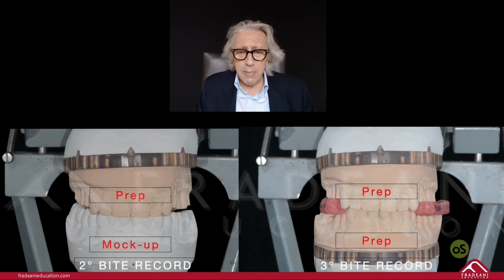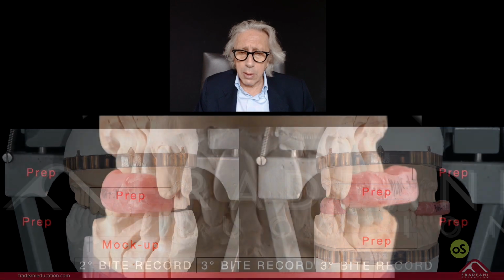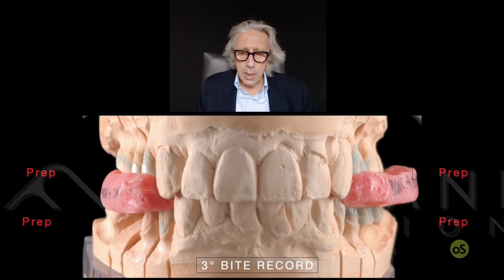So 2 of them are already good. So preparation with mock-up can be upper or lower, or the other one is one of the 2 that we have seen. But 1 mock-up has to be maintained to take the bite record with the preparation. It can be the lower, it can be the upper, it's the same. And the other one with prep against prep. And that will be easy. So 2 of them allow you to do the cross-mounting procedure. This one is the last one that you have seen, prep against prep.